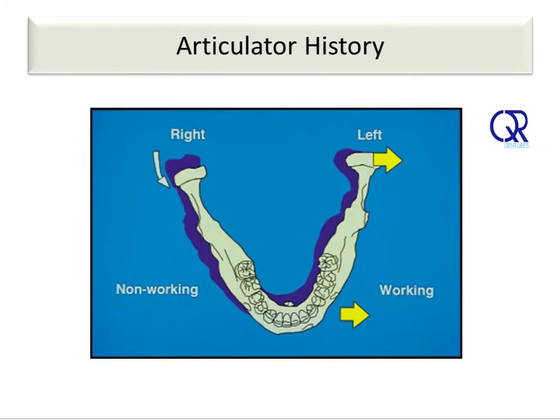Semi-adjustable articulators of today have some significant limitations. In reality, lateral movements to the left are not the same as those to the right. It is also non-linear. And we should not forget the effect of compression of the tissues as a mandible moves under load.